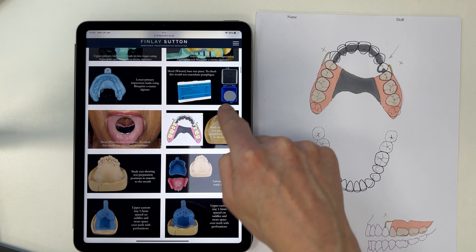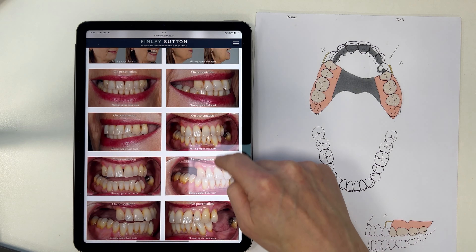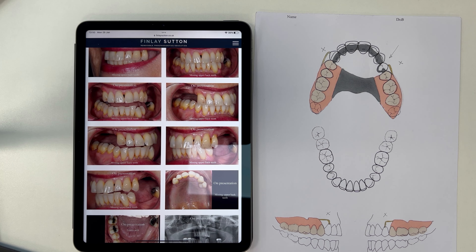Once I've done the design and drawn it out, just to make it super neat and make it look like that, what I do is just use a black marker pen to finish it off cleanly.